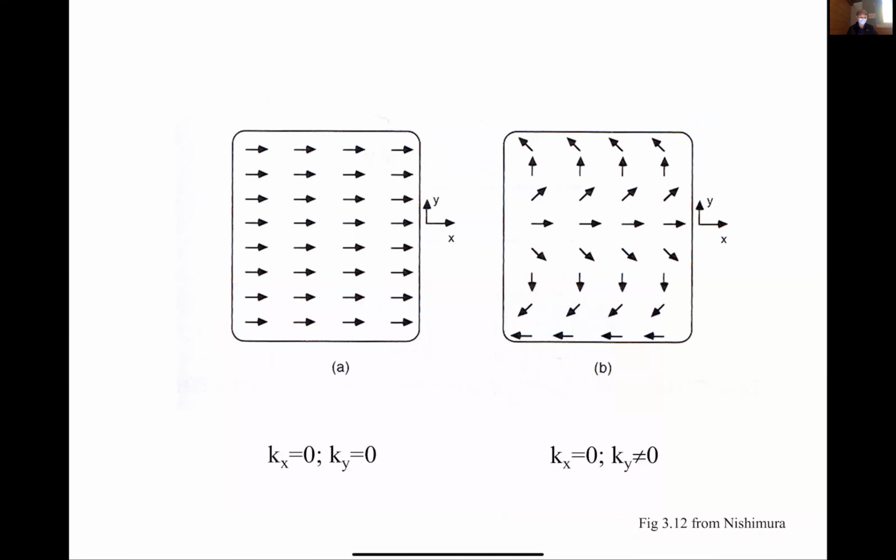Just to get a better sense of how to think about K-space. A very important part of K-space is the center, Kx equals 0, Ky equals 0. From the point of view of the phasors, that's where all the phasors are lined up, all pointing in the same direction. That's typically what we assume happens once you've excited the magnetization with the RF pulse, and you assume it's very short, then at that point you start off with everything lined up. So you start off at the center of K-space.